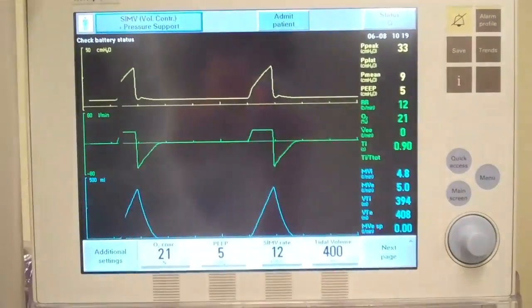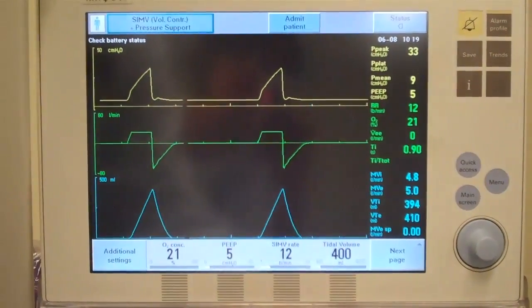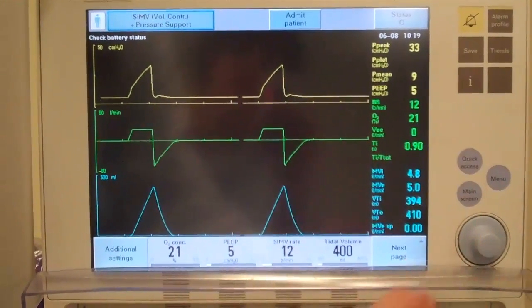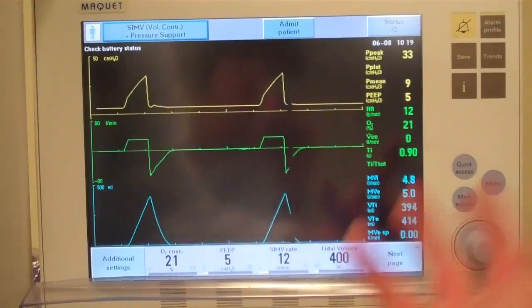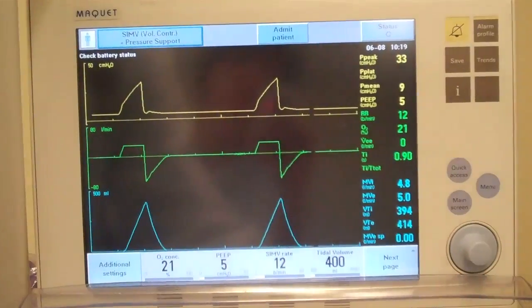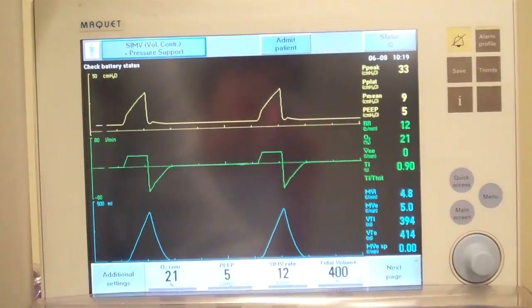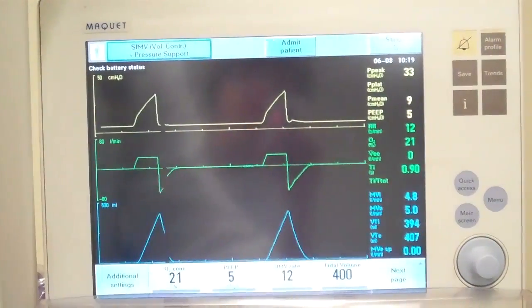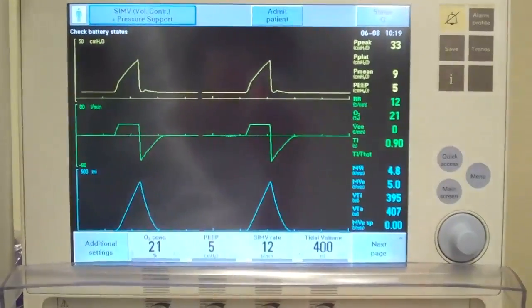All of these plateau pressures have to be gotten during a positive pressure breath. The reason I use the pause pressure setting is because it's just so much easier. The thing you've got to remember is to make sure that you take it off whenever you get finished evaluating.